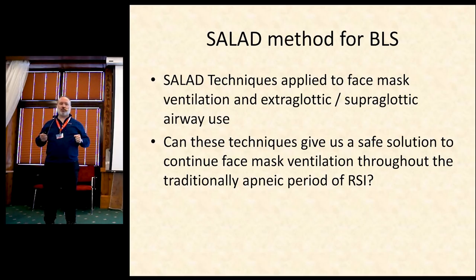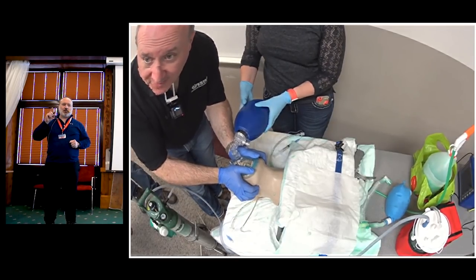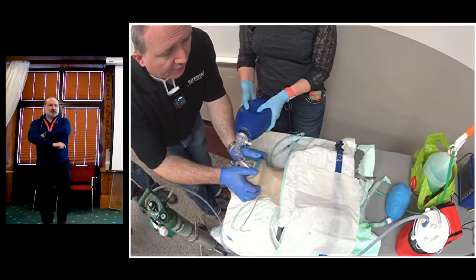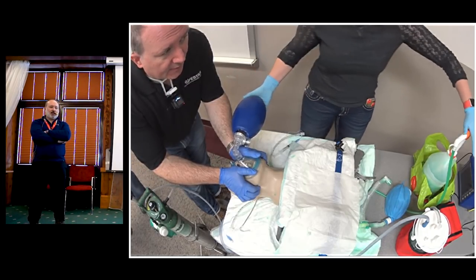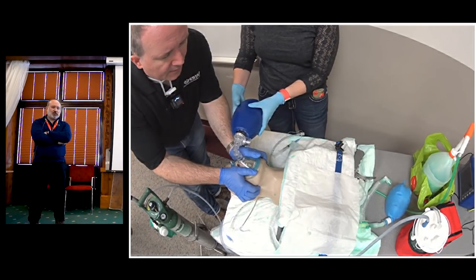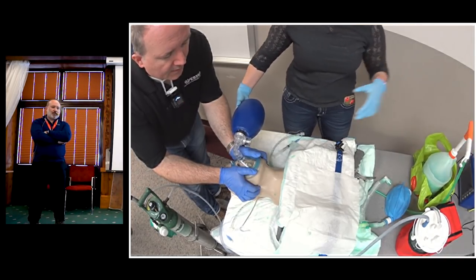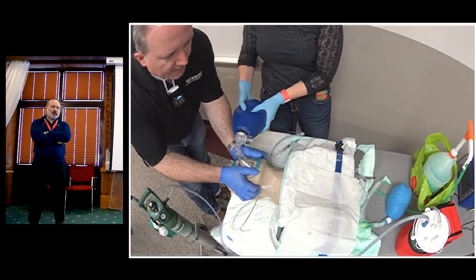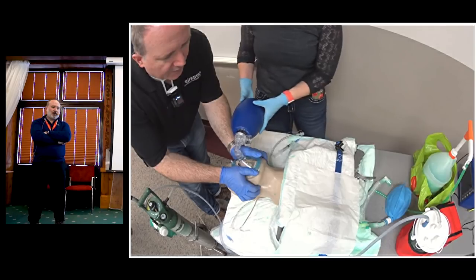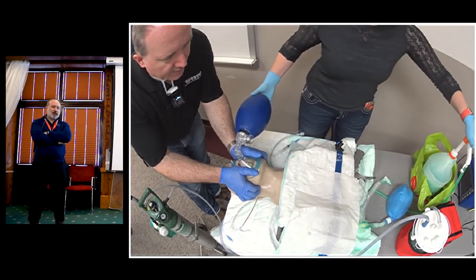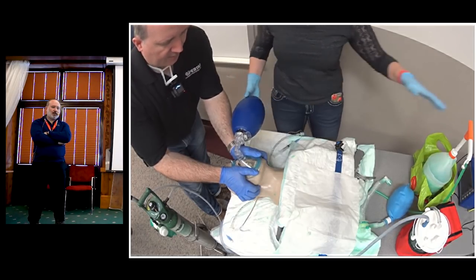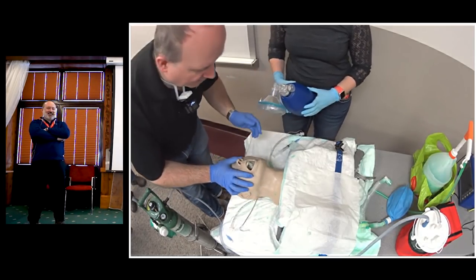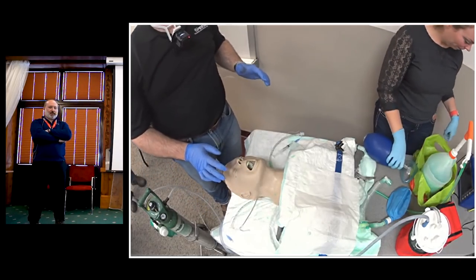The question we're going to ask here is: can you ventilate throughout the traditional apneic period of RSI? I'm face mask ventilating this mannequin and we're going to put airway contaminant into it. My assistant is a trained HEMS paramedic. She's going to look to see when she can feel a change in compliance of the self-inflating bag. Tell me when you feel the airway contaminant. We're going to turn on the video laryngoscope and inspect the hypopharynx — let's see how much airway contaminant we have in there before she felt she had a problem. That's right up to the glottis. Let me suction that out.